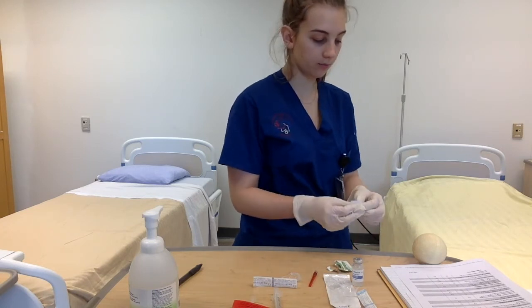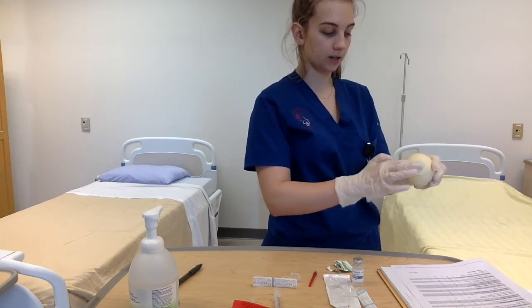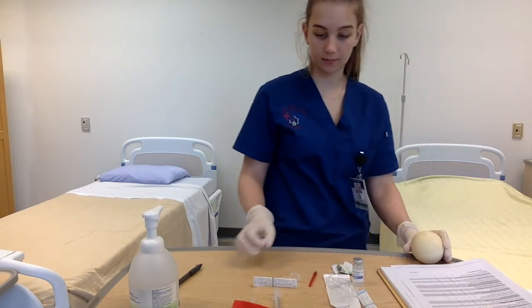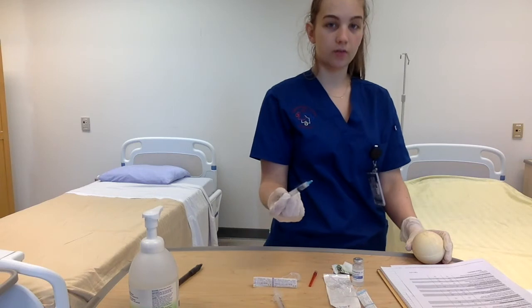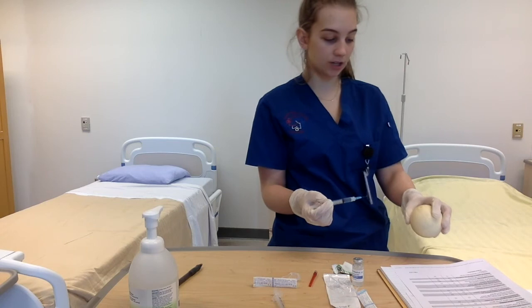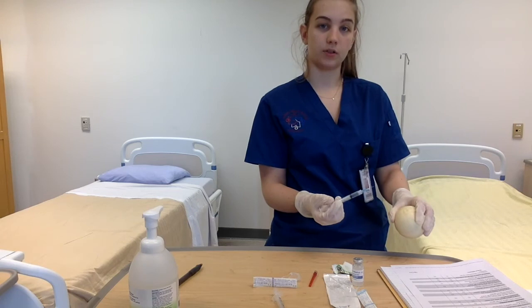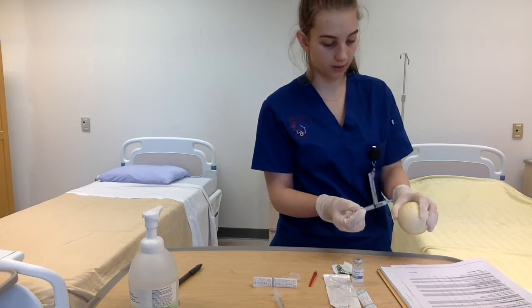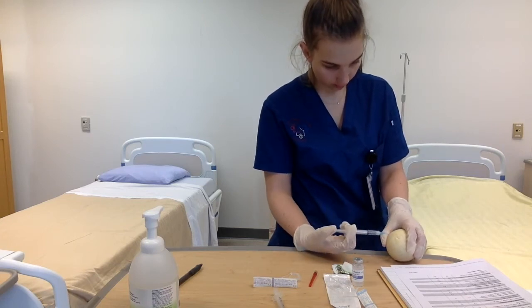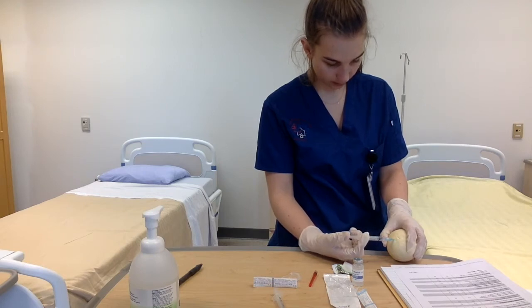Make sure that it's nice and clean before I give the injection. So I'm just going to cleanse it in a circular pattern like that. Okay, and then I'm going to get my needle ready. And for this injection, I'm going to be injecting it at a 45-degree angle and pinching the skin a little bit to ensure that the needle goes into the right place. So I'm going to make sure that it goes in at an angle like this. Okay, get ready. And I'm going to inject the medication.